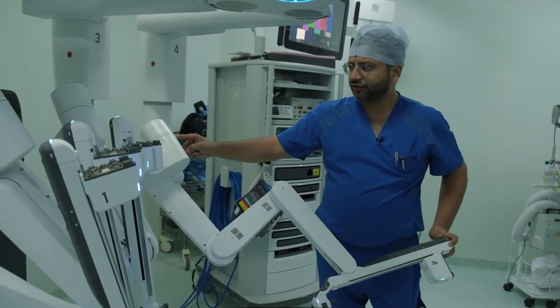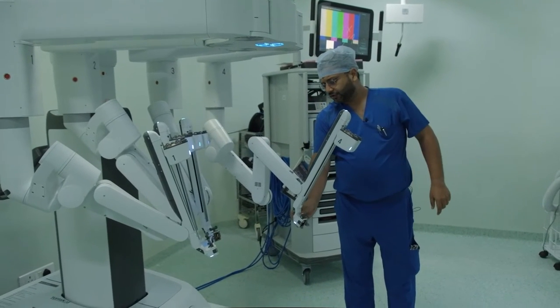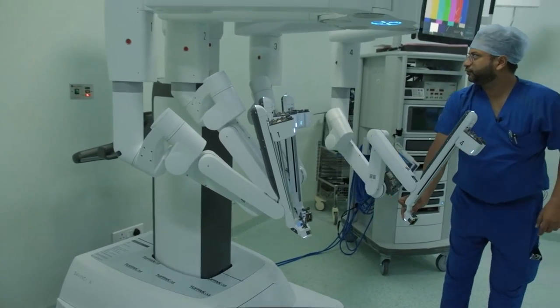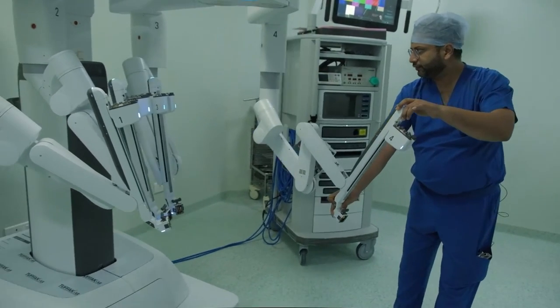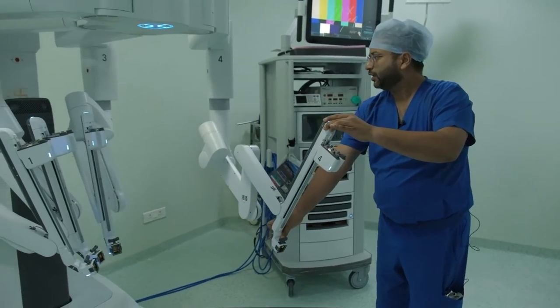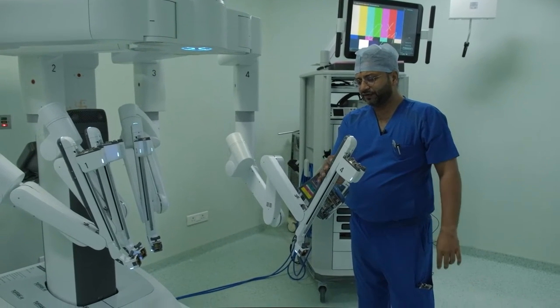And this movement of the arm can also be done from the master console by the surgeon. Now there is something called the clutch button here, which if we move, it is going to control the proximal set of joints. And once these proximal joints move, they are going to allow us to change the port position or change the arm position. And this cannot be done from the surgeon console. This is only applicable from the patient side.